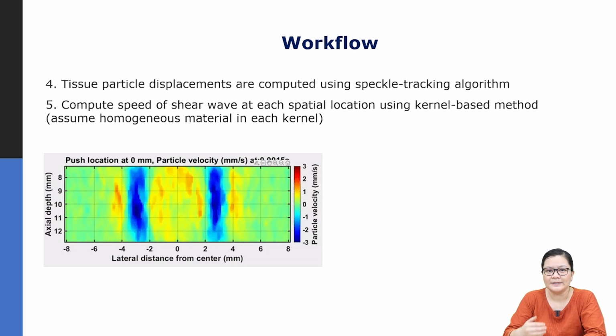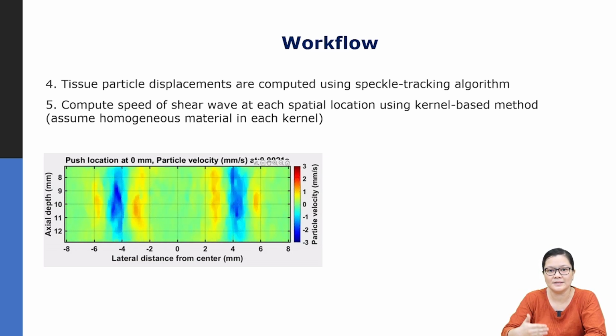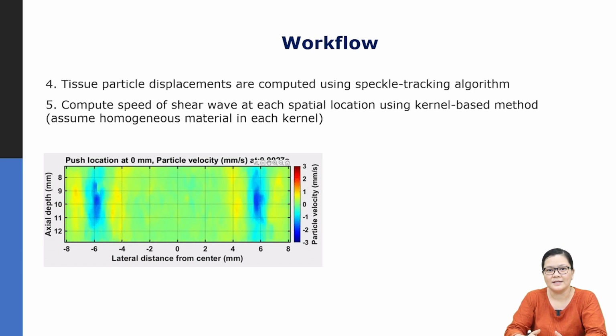After you've obtained and tracked the shear wave as a function of time, what you are doing is taking snapshots, B-mode images as a function of time, so you have this 3D data set, which corresponds to the lateral and axial directions, and also the time direction. In elastography terms, we call this the slow time direction.